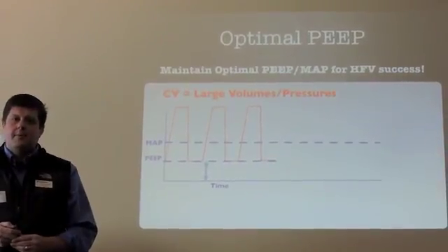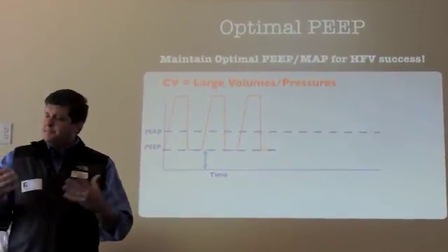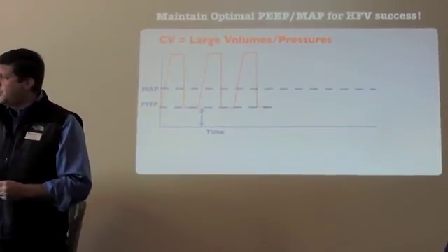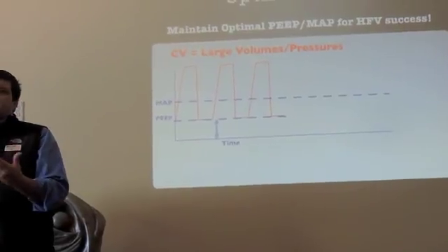have enough PEEP. So how much PEEP do we need, and what kind of PEEP should we be on? Well, the real question here, guys, isn't how much PEEP should we be on.